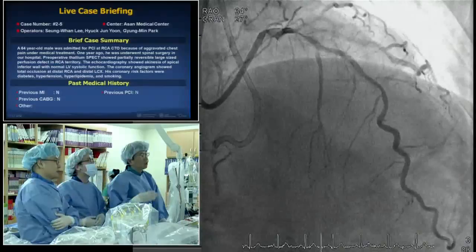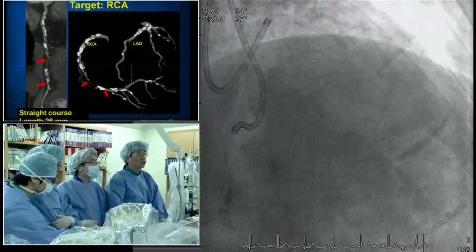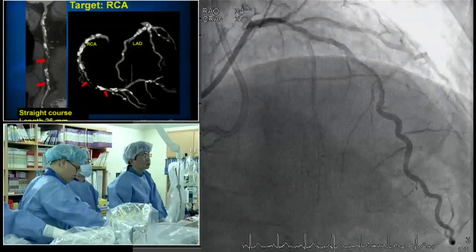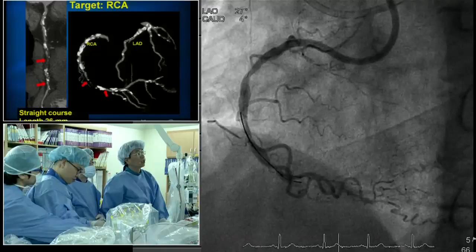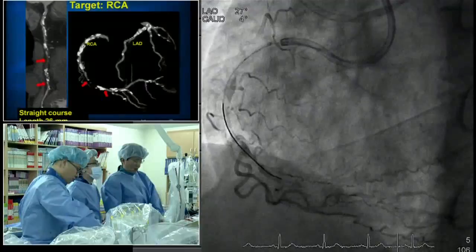And if we fail the antegrade approach, we try the retrograde approach. However, in the proximal portion, there is some narrowing around the proximal LAD and some calcification. So the retrograde approach has a chance of donor artery ischemia. So the initial plan is just to negotiate the micro channel. Next. Next. Okay. This is on the back of the Fine Cross. We try the negotiation of the micro channel.